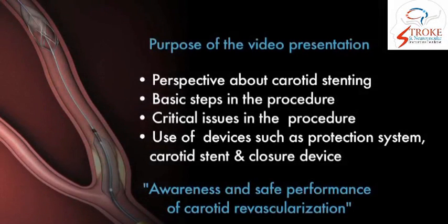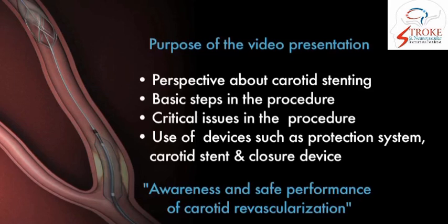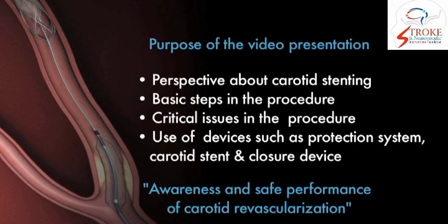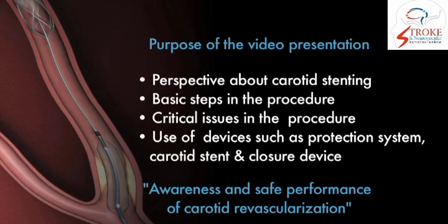The purpose of the video presentation is to give you a perspective about carotid artery stenting and to explain to you the basic steps in the procedure and the critical issues in the stenting procedure. You should also learn how to use the devices such as the protection system, carotid artery stent and the closure device. Afterwards, you should be well aware of the procedure and be able to perform it safely. Ultimately, our purpose will be served if you become well aware about safe performance of carotid artery revascularization.